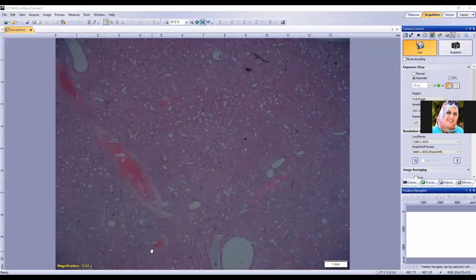It would be fibers of pink color, yes. Connective tissue. Yes. So specifically, thinking through, and this is a little bit more GenPath, connective tissue or mesenchymal tissue is going to be a mixture of cells and matrix, isn't it? Yes, it would be connective tissue of fibroblasts and some collagen fibers. Yes, exactly. So those are the specific descriptors that we're looking for.